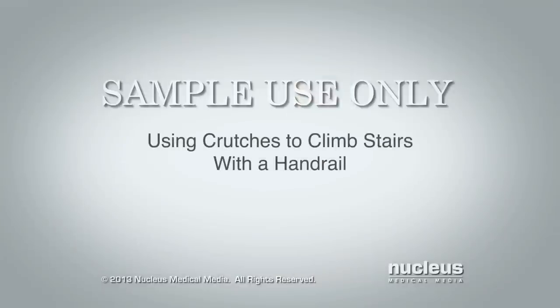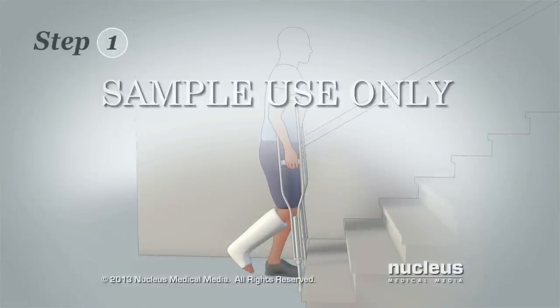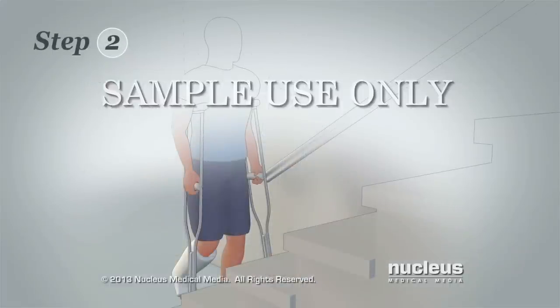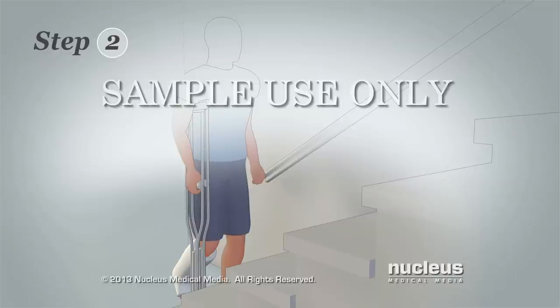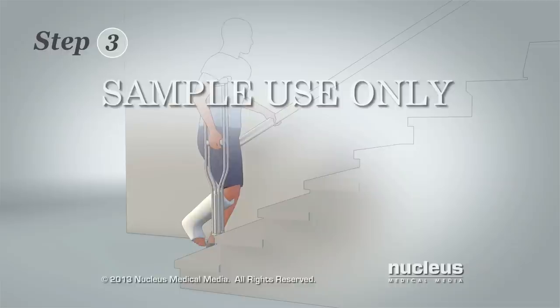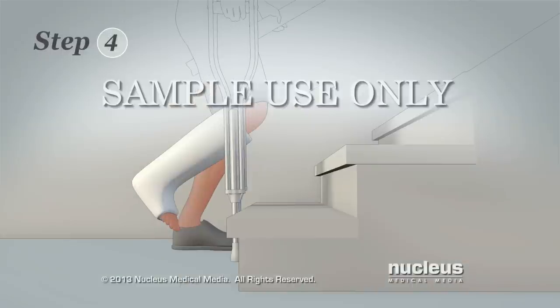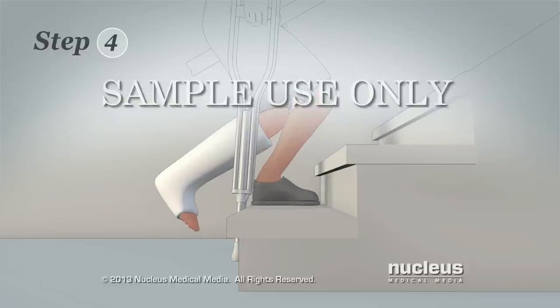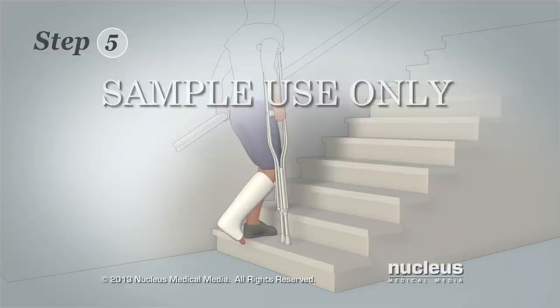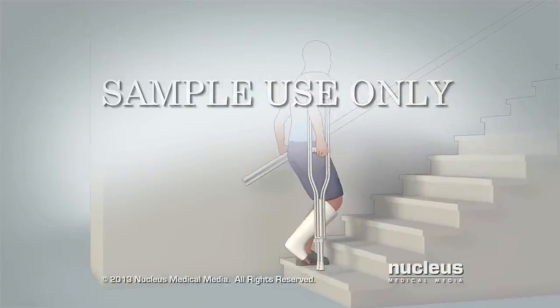Now you'll learn how to use crutches to climb stairs that have a handrail. Step 1: Begin as close to the stairs as possible. It does not matter which side the railing is on or which leg is injured. Step 2: Move the crutch nearest the railing to the opposite arm and hold both crutches by the hand grips with that hand. Step 3: Grab the railing with your free hand. Lean your weight on the railing and the hand grips of your crutches. Step 4: Lift your uninjured leg onto the next stair step. Step 5: Pull your crutches up with you onto the stair step. Repeat this process for each stair step.